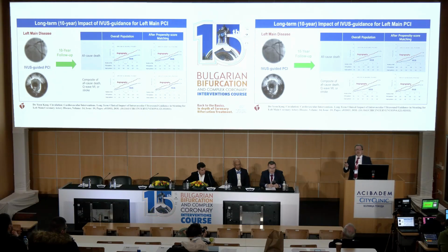myocardium. And we know from the literature that we have 10 years follow-up for the patients showing that this effect of the usage or guidance of IVUS persists for at least 10 years.